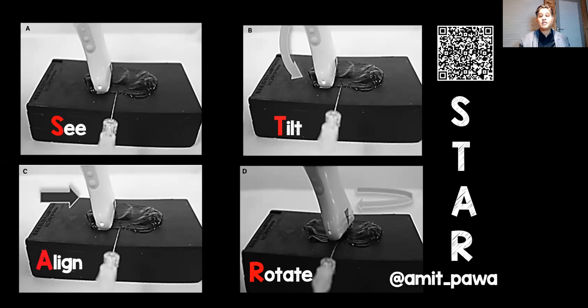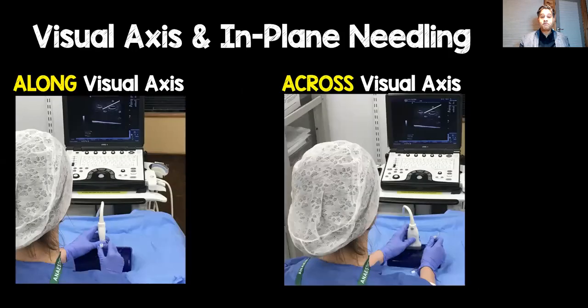And when they did this study, when they described this technique, they found that residents were much more likely to identify the needle tip in an in-plane situation if they applied these probe maneuvers in a sequential manner like this, rather than just think, oh, pressure, alignment, rotation, and tilting. So this is something to bear in mind.